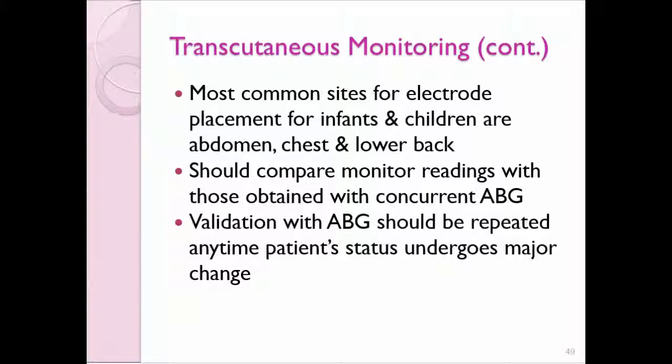And so having these monitors, they don't replace analysis. You still may need to do the blood gas analysis in the event of a patient's status change, but as long as things are continuing to go as expected, then probably the monitor is reasonable, and we don't have to subject the patient to a puncture or other blood draw.